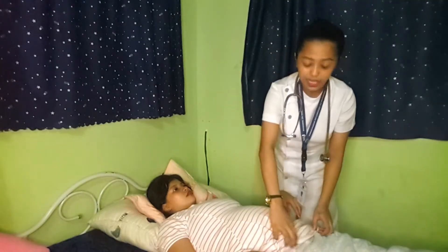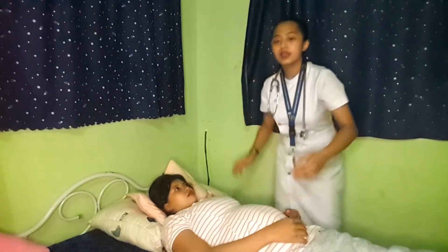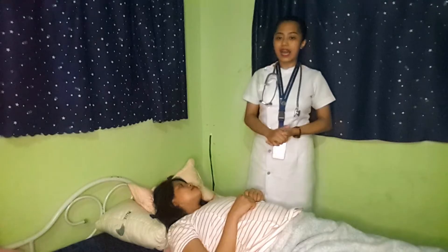After getting the measurement, we need to note it and position the client in a comfortable position. Then we need to wash our hands and document all of the data that we gathered. We're now done with the fundal height measurement.